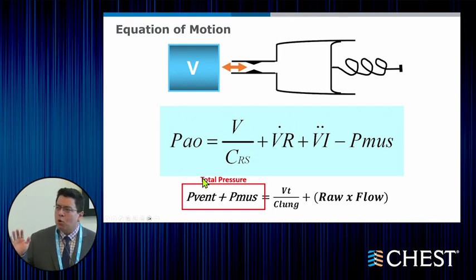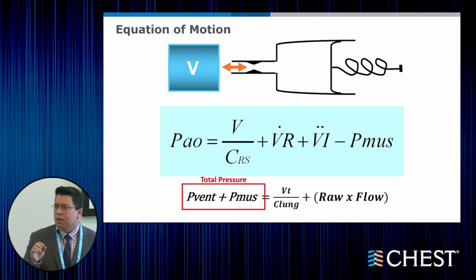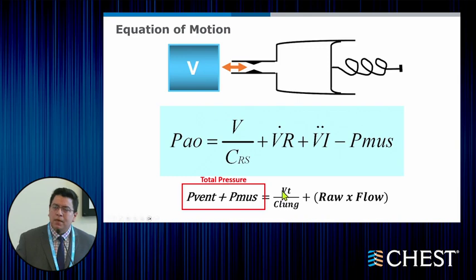So I want you to go back to that memory of ventilating a patient that had a very fibrotic lung, or a lot of consolidations, or an advanced ARDS patient. That patient is going to have a very low lung compliance.